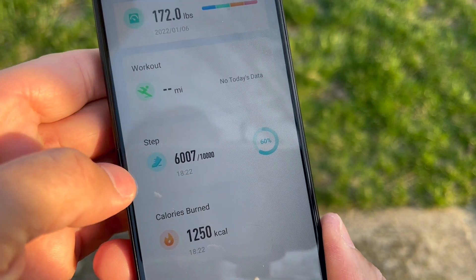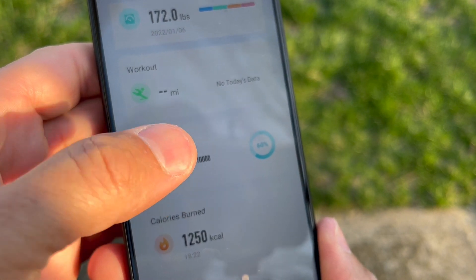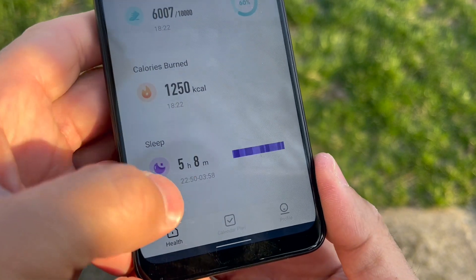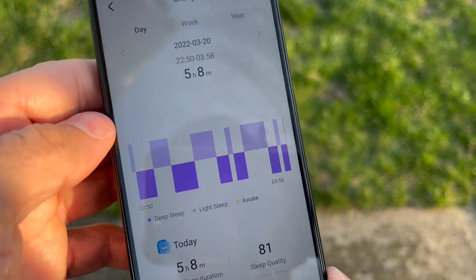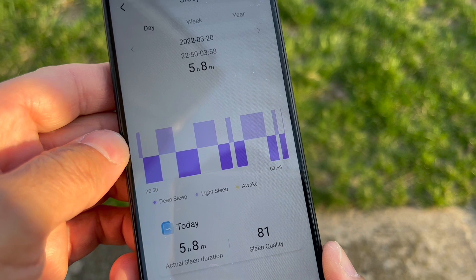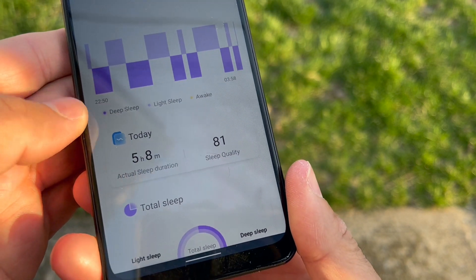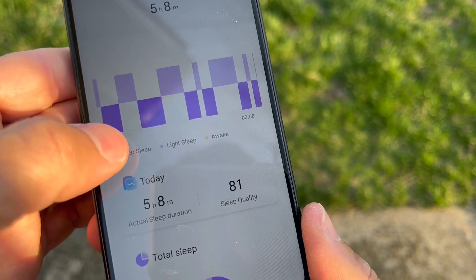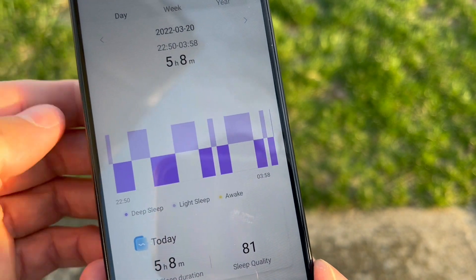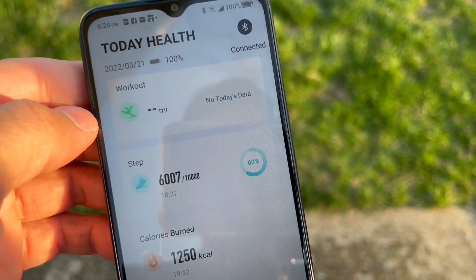Going back, you can see my weight, workout data, steps for today — 6,000 steps with a goal of 10,000 — and calorie burn at 1,200. The sleep monitor shows I didn't sleep much. You also get sleep quality rated at 81, with deep sleep and light sleep patterns shown. I was all over the place — I think I took a nap and was restless.